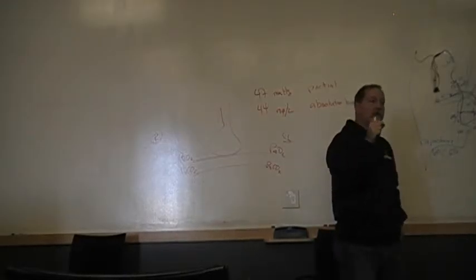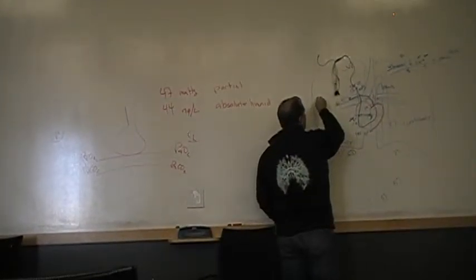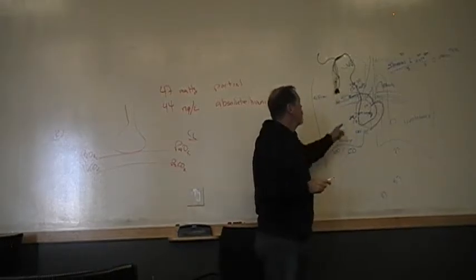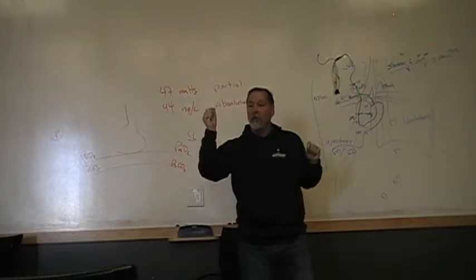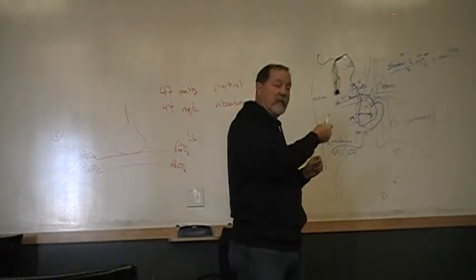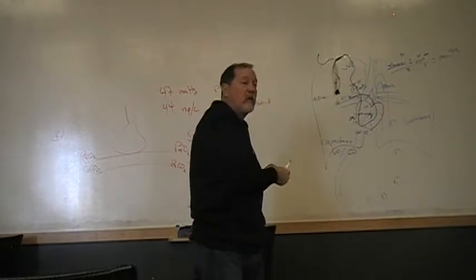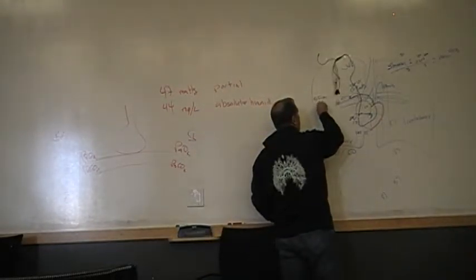Once it occludes the vascular wall of that blood vessel, there's no flow. So you can see that if we inflate the balloon and stick it into the pulmonary artery such that there's no flow distal to the tip of that catheter, beyond that catheter, if there's no flow, then there's no resistance.